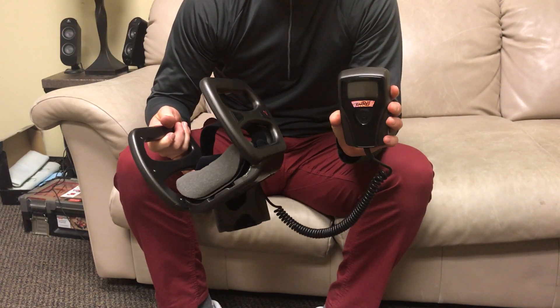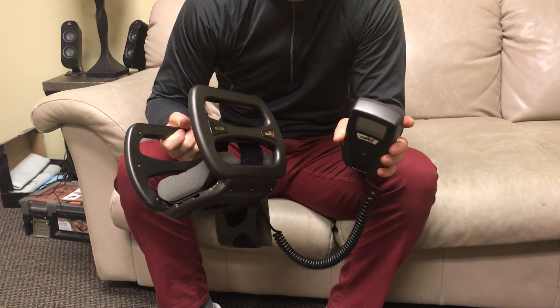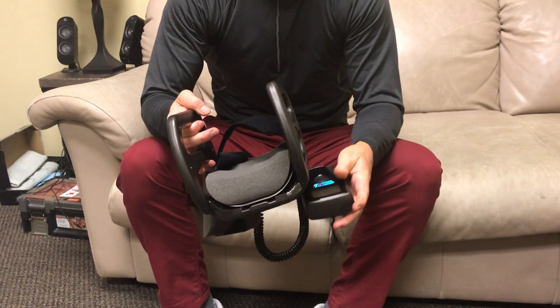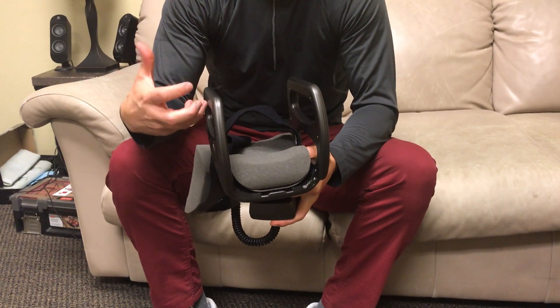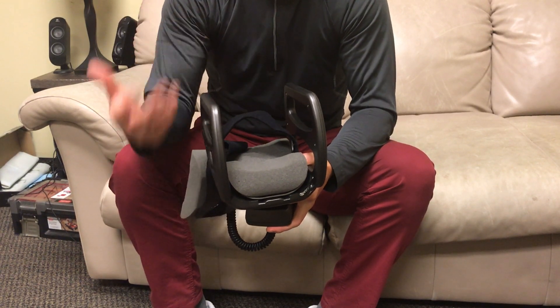This is your CMF OL-1000 Combined Magnetic Frequency Bone Growth Stimulator. It's a dual coil — you have one coil here and one coil here. With a bone growth stimulator, in order to build bone, you need to create osteoblasts.